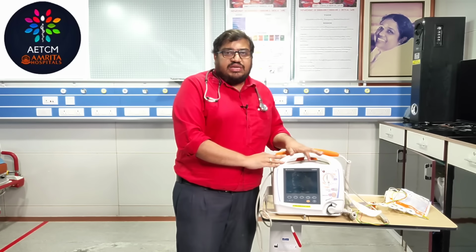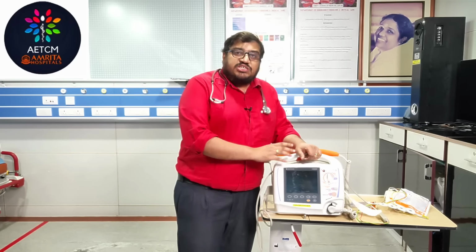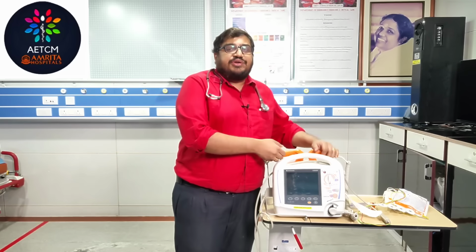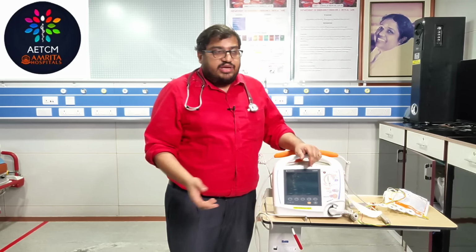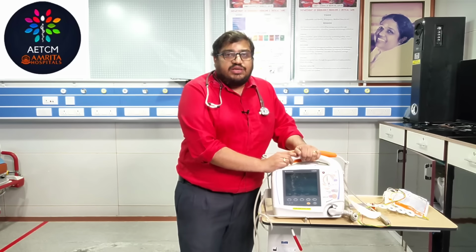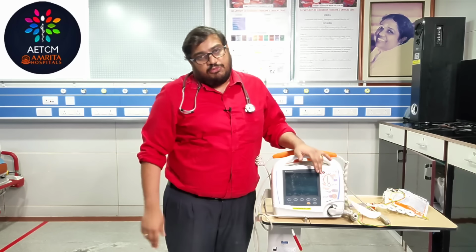A very important thing is that you need to check the device before going for your duty, because sometimes the machine will be malfunctioning. At the time you have a patient with cardiac arrest with ventricular fibrillation, you try to use this machine and it will not be working. So always make a point to check your machines before entering into your duty, because this is life-saving equipment. If it is not working, it is done. There is no other treatment option for VT or VF in a cardiac arrest. The treatment of choice is defibrillation.